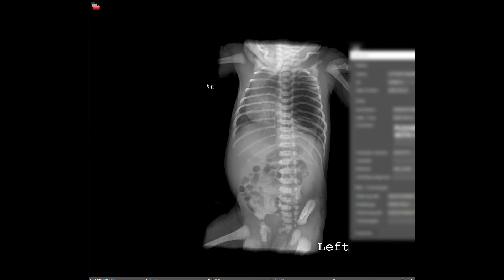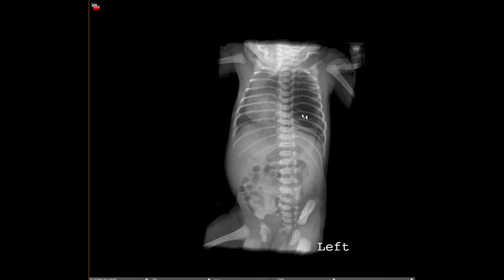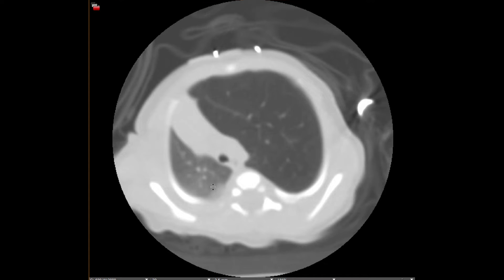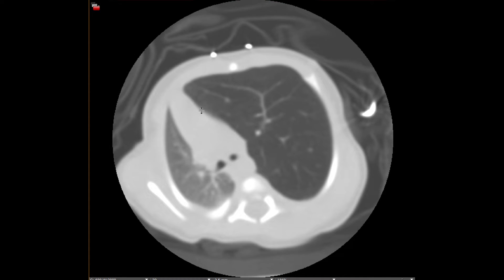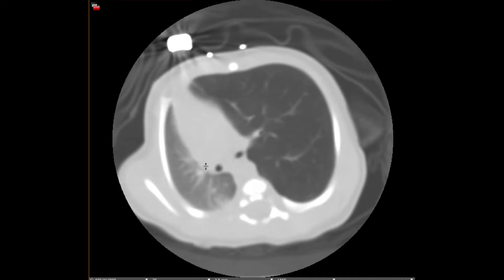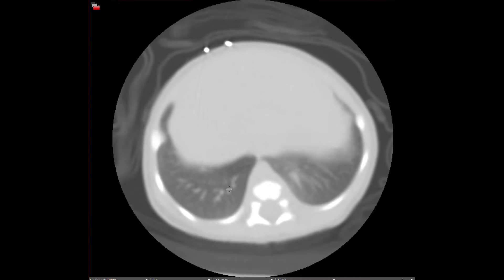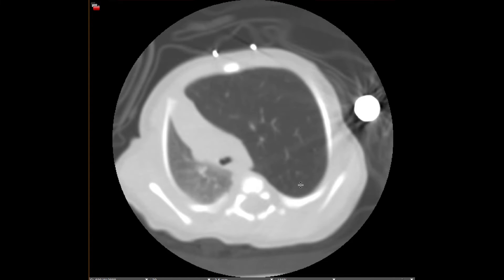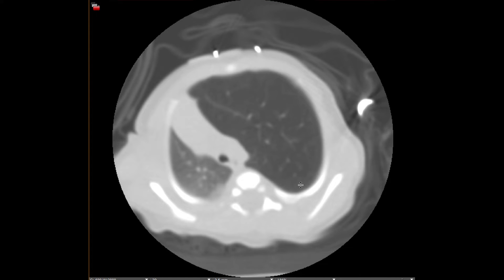Switching to rarer entities — congenital lobar hyperinflation. The left upper lobe is the most common site. On this baby gram you can see that the left upper lobe is hyperinflated, and on CT the left upper lobe is hyperinflated with a paucity of vascular structures and contralateral mediastinal shift while the lower lobes are normal. The left upper lobe is the most common lobe involved, followed by the right middle and upper lobes. The lower lobes are almost never involved, and this is almost exclusively seen in infancy.